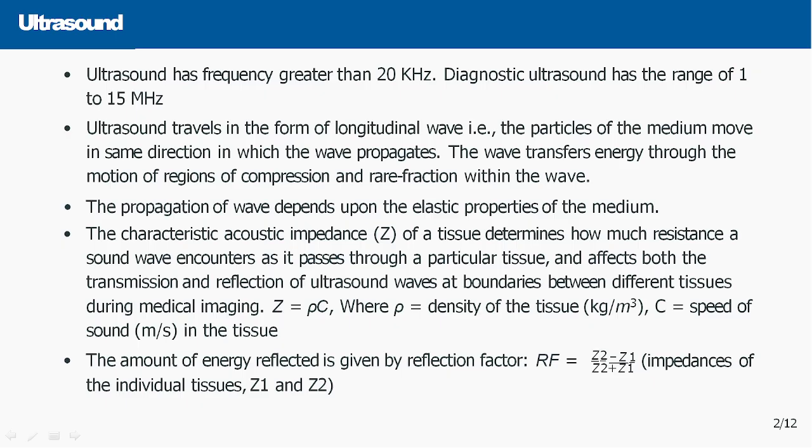This is for the case where the signal is at normal incidence, meaning this is your normal and this signal is normally incident on these mediums Z1 and Z2, which is the interface.